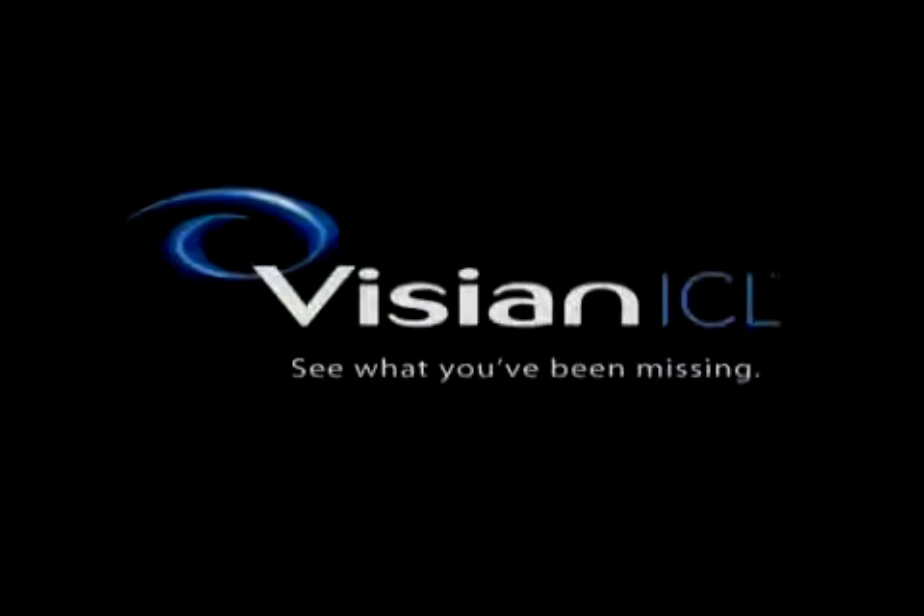With the completion of these steps, your Visian ICL will be comfortably and effectively in place.